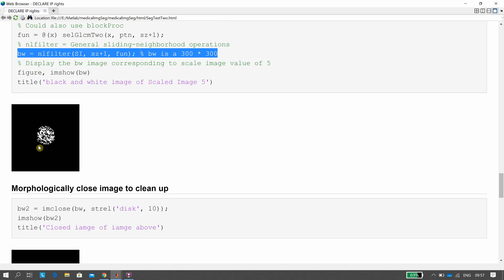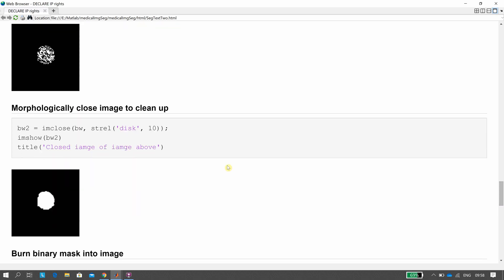There's your image where both positions are 5, and you can see there are quite a few holes in it. One way of closing up the holes is to use IM close, and IM close is dilation followed by erosion. K suggested a value of 10 — there's no way of knowing that in advance; he just did it by trial and error, probably trying 6, 8, 12, 14 before settling on 10. There's the closed-up image.